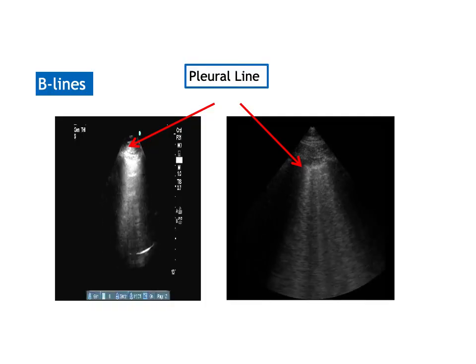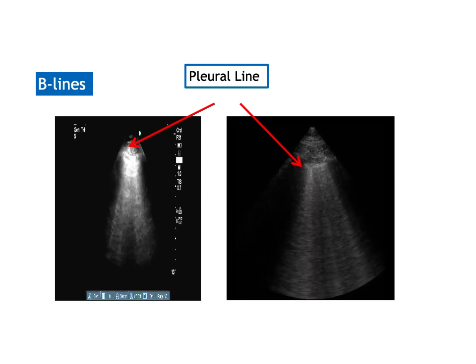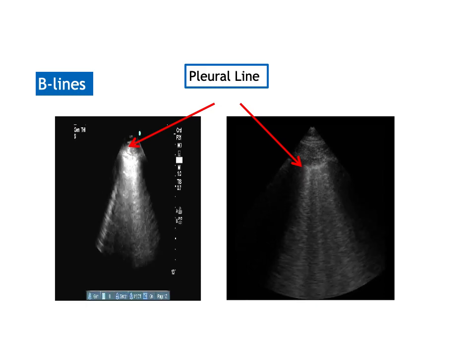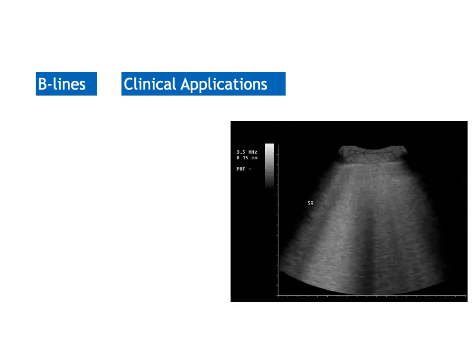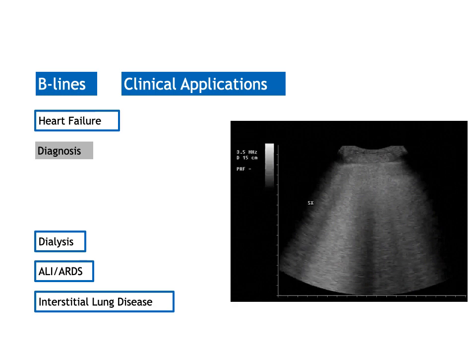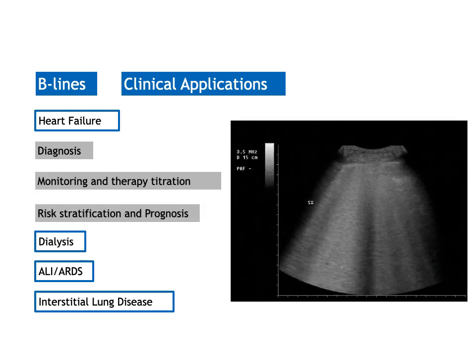And these are other different examples of B lines. On the left side of the screen, you could still barely see a bit of A lines underneath, but here you don't see any A lines. And remember, we look for B lines systematically on both lungs in all the described zones.